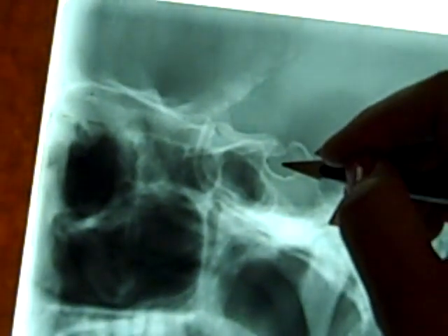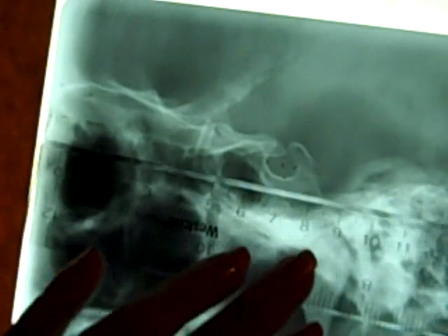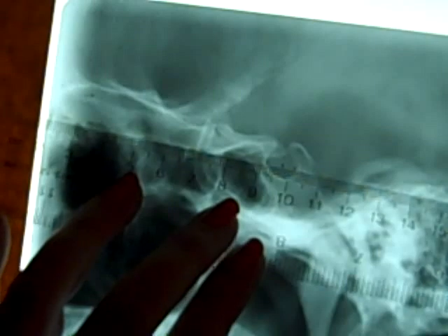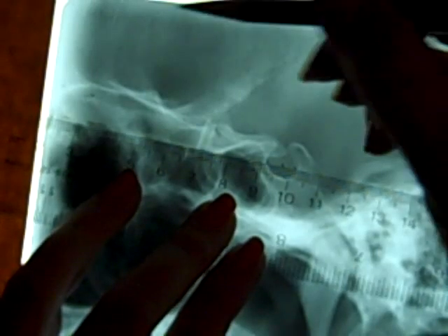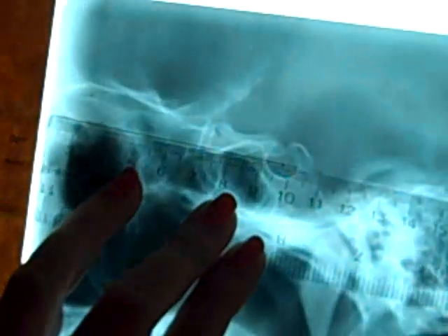The second dot is in the center of the sella turcica, so I'd put it about right there. And then using my ruler, and I just dropped my pencil, I would draw a line from here to here, and that would be the first line for basilar angle.